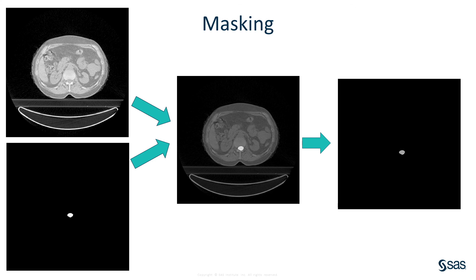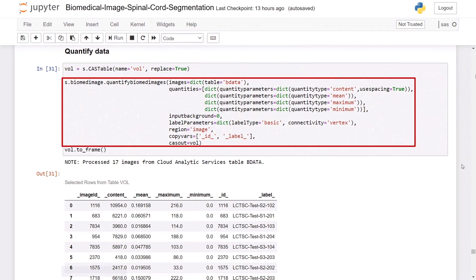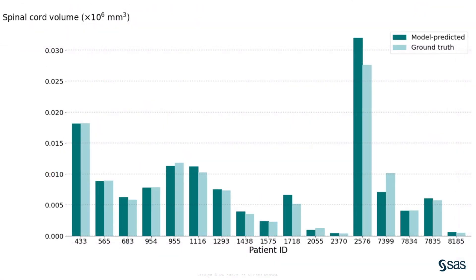Now that we have a mask of exactly where the spinal cord is, we'll use the mask specific step in the process biomed images action to fill the binary mask with the original pixel values of the image. This is useful because we can now analyze the change in pixel intensity values for patients over time. Specifically, if we had a patient with a lesion on their spinal cord, we can monitor the lesion by looking at the change in pixel values. Using the Quantify Biomed Images action, we can quantify a variety of different metrics for the spinal cord region. Here I have plotted the ground truth spinal cord volume against the predicted spinal cord volume from the network, and it can be seen that the network prediction mirrors the ground truth pretty accurately.